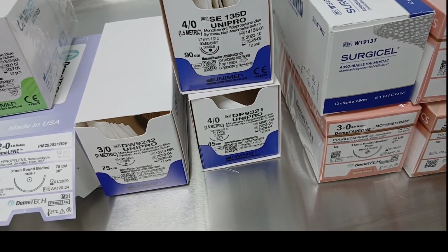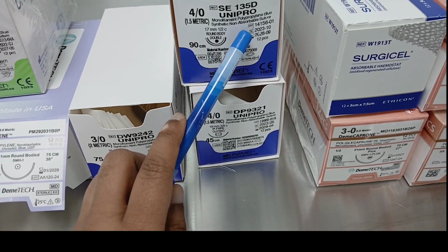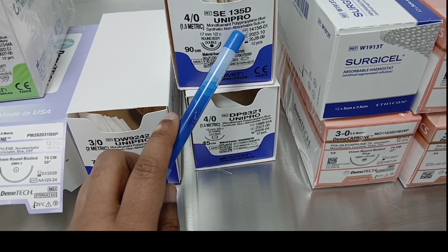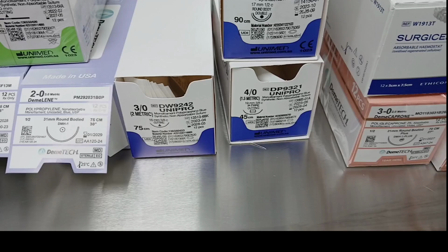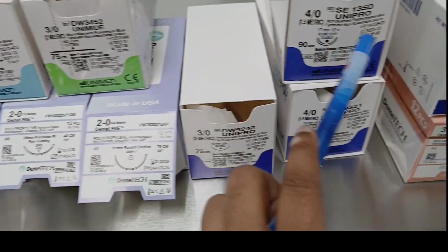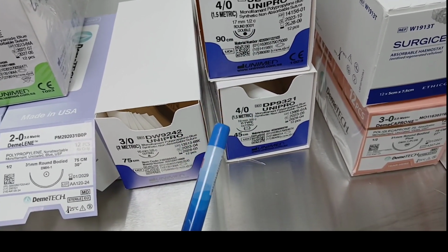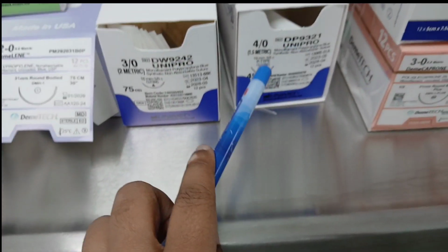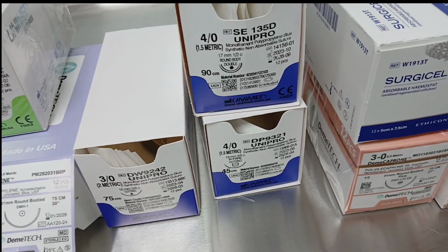So once again I will explain how to check basically suture material. First we have to see the manufacture date, then the expiry date, then the lot number, then we have to check the suture number. For example 3-0, 2-0, like that we have to check the suture material number. Then we have to see what kind of suture we are going to use. Then we have to see whether it is a single needle or double needle. This is the basic instruction.